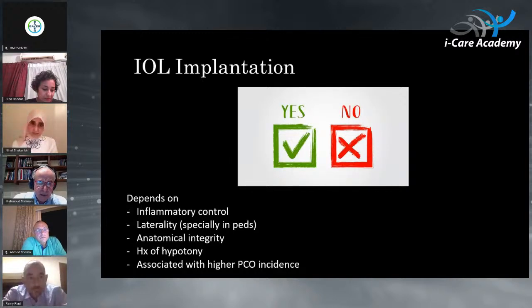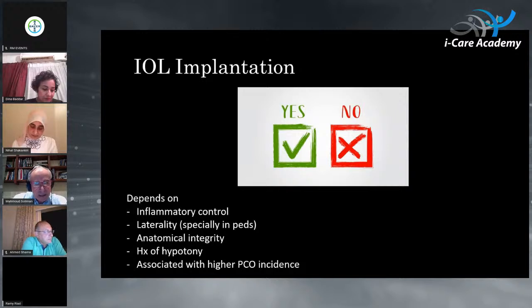series of patients which I've been implanting, doing in-the-bag implantation, of course, and doing a combined vitrectomy with them. And the results were actually excellent in the long term. They might sometimes develop some posterior synechiae on the lens, but even if this happens, you can do a YAG membranectomy and disrupt the membrane.